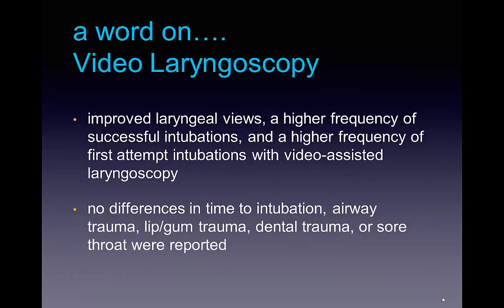Just a word on video laryngoscopy. There is some notion out there that video laryngoscopy sometimes can cause difficulty in first pass or cause the length of time for delivery of the endotracheal tube to be increased, and this is in fact not the case. Video laryngoscopy has been shown to improve first successful intubations and first attempt intubations, and doesn't usually add additional time in the hands of an experienced provider. What is important to note, however, as we've alluded to earlier, is in cases where there are a lot of other things in the airway, such as secretions or blood, sometimes these things can very quickly obscure the view from the video laryngoscope, in which case it becomes a useless device, and in that case, sometimes direct is actually better.